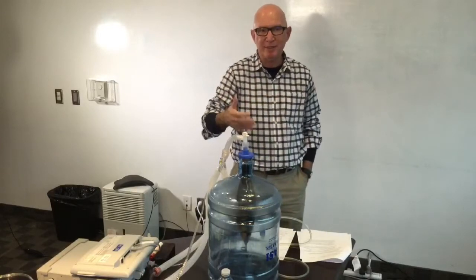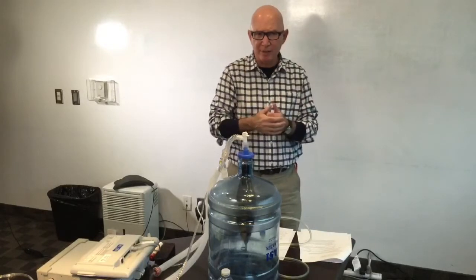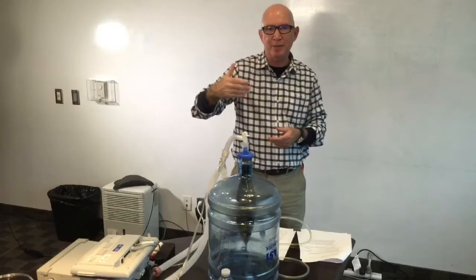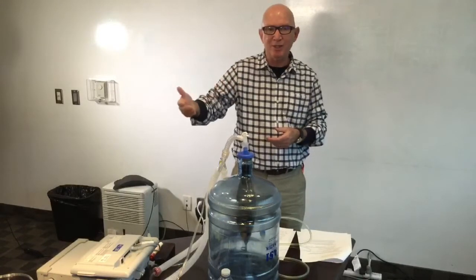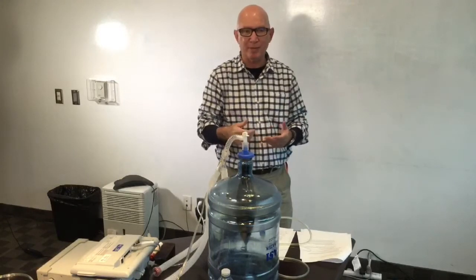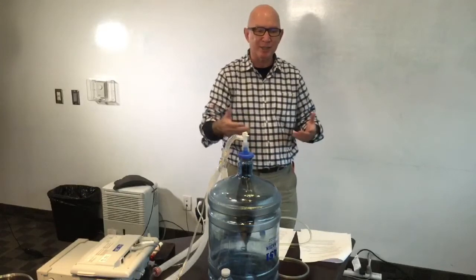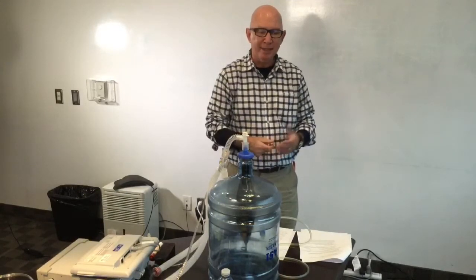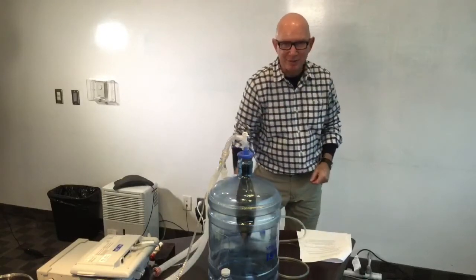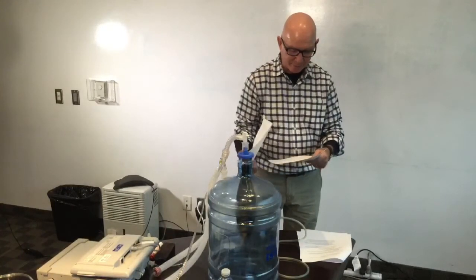Granted, the inspiratory times, etc., are going to be different in the flow rates, but nevertheless, there's the risk of breath stacking in that sense from a high respiratory rate with an inadequate expiratory volume exhalation. Either one could generate itself into an increase in functional residual capacity and the dynamic hyperinflation of the chest, which leads to all its own problems as well. So at the end of the day then, AC and pressure support. So I hope that answers that particular question anyways. And we did get into a bit of the dysynchrony piece at the same time too.